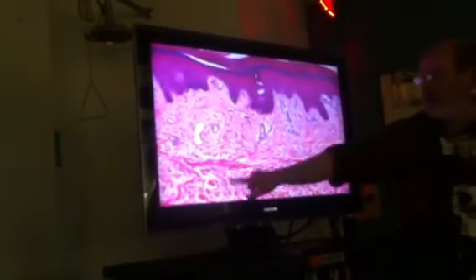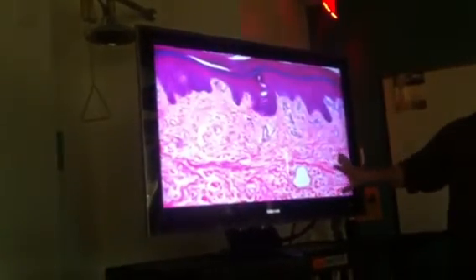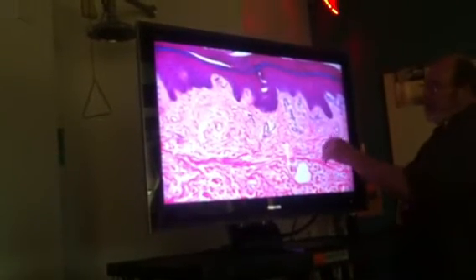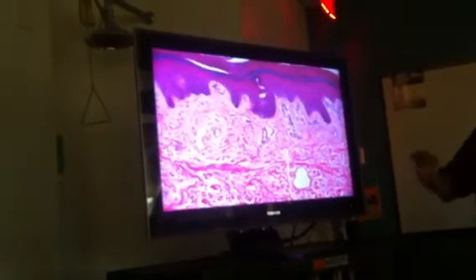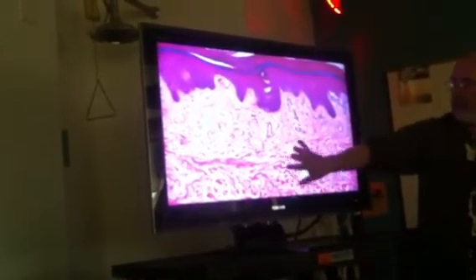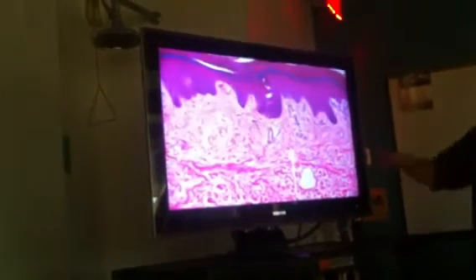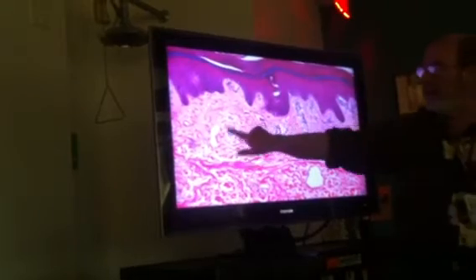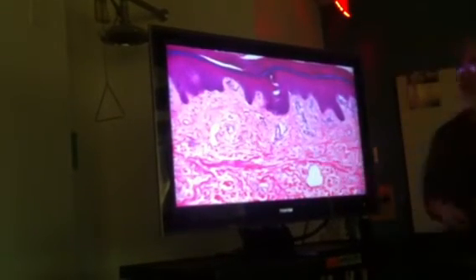The reticular dermis is our best view of dense irregular connective tissue. This looks like smooth muscle to some extent, except there's less blood supply and fewer nuclei. And if you look really carefully at smooth muscle, you can see that this stuff that has that general appearance is more cellular. These are all sweat glands all over here. That's all sweat gland. There's a blood vessel right there.